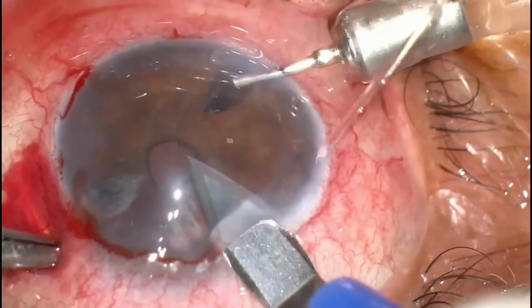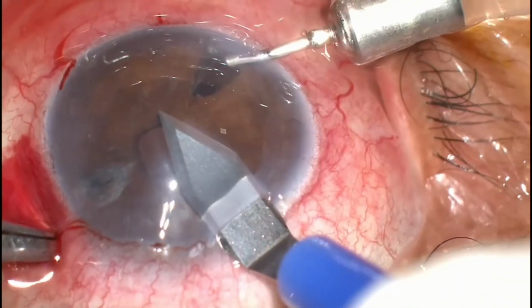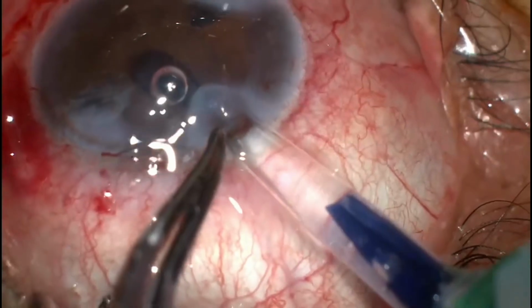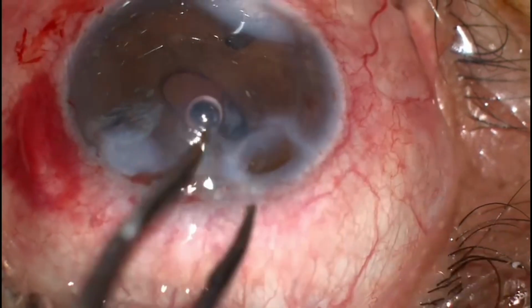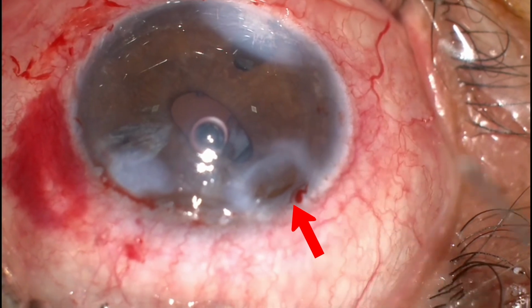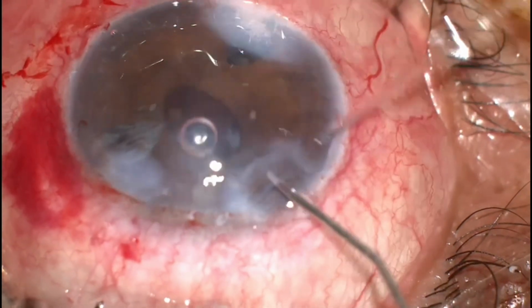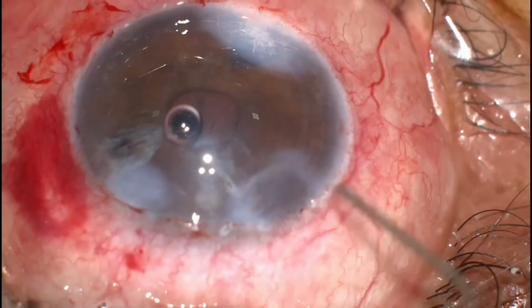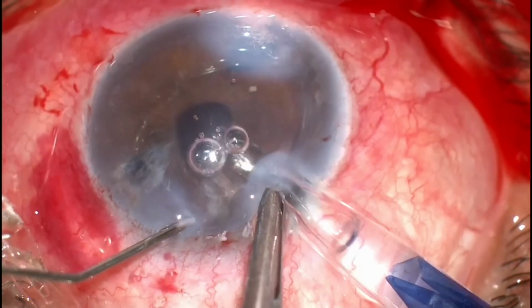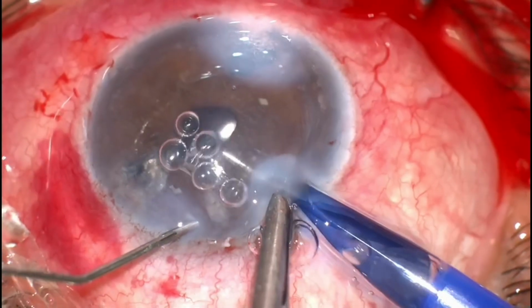So once this is done, I extend my incision to full thickness in order to put the graft inside. So the preloaded PDEK graft is taken, and again you can see the problem there is I start seeing iris plugging my wound, and it is not allowing me to go in freely with my injector. Try to hydrate the side port and try to go in with the injector inside.